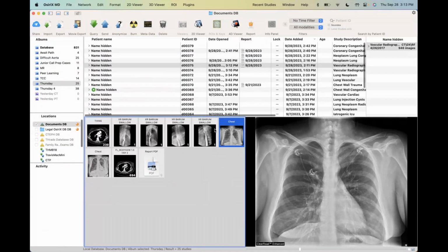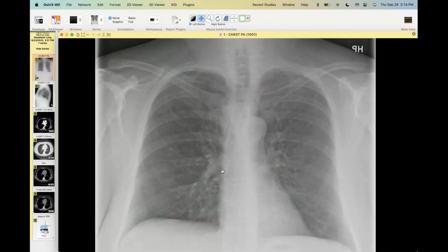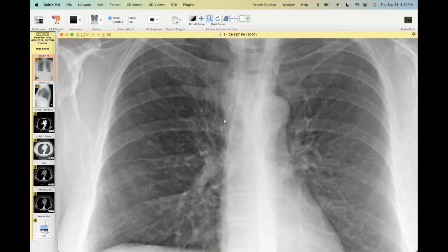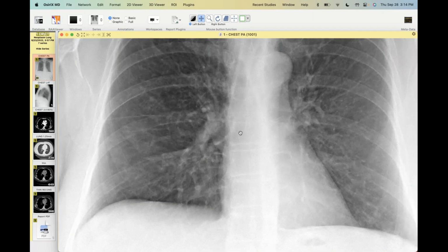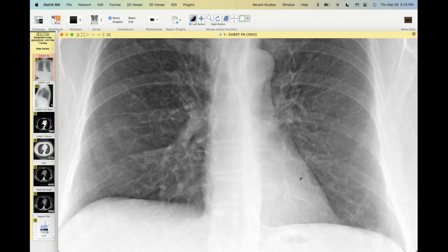Right, exactly. Speaking of another rare anomaly, this one was just referred to our ILD conference. I don't know if I would just say that the lungs look a little bit busy on this radiograph. What do you guys think? I'm trying to zoom in. It's hard to tell on a webinar, but I'm underwhelmed. Yeah, okay, that's fair. And she had COVID.